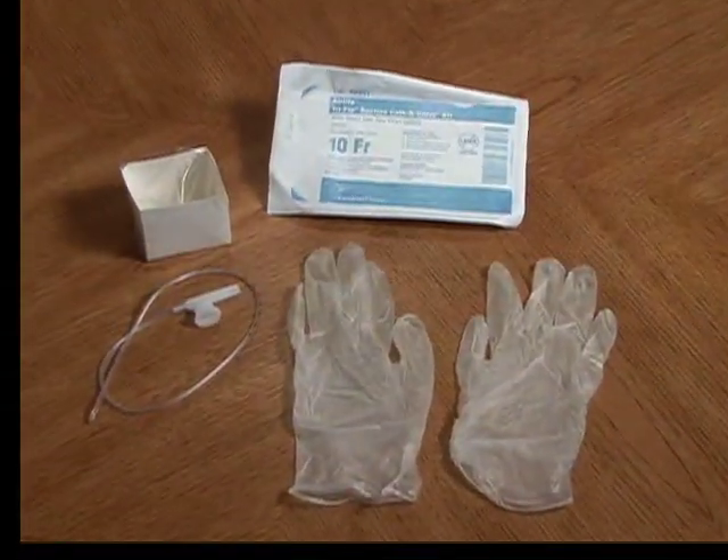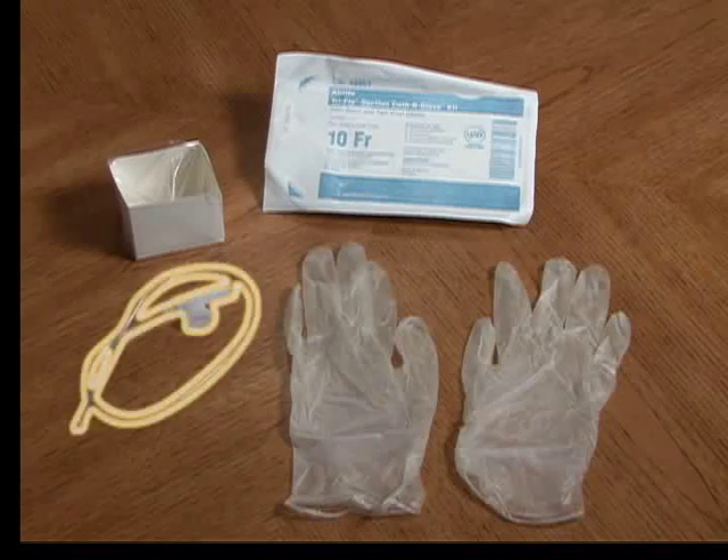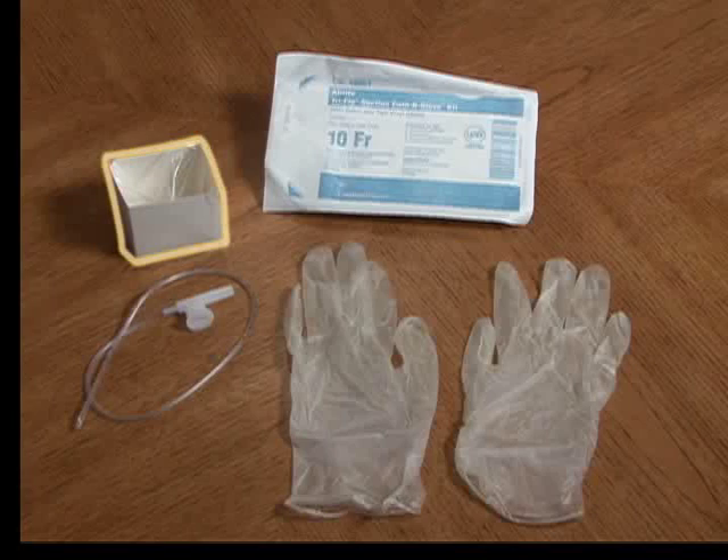Keep in mind that your medical equipment provider may have equipment that is essentially the same, but may look slightly different due to different manufacturers. Suction catheter kit — this will include at least one sterile glove, one sterile suction catheter, and usually some type of container to hold the HME while suctioning or to put saline in to clean the catheter.